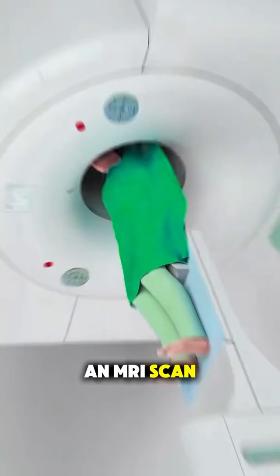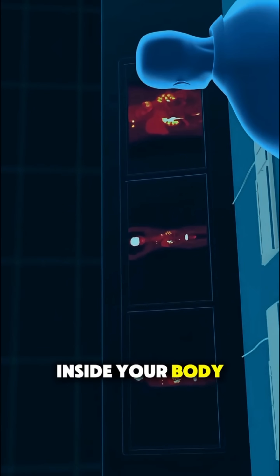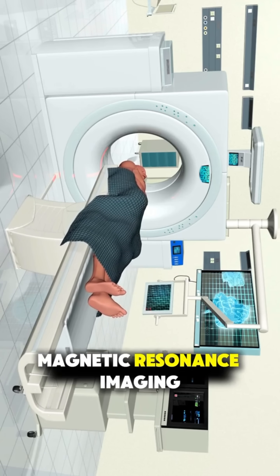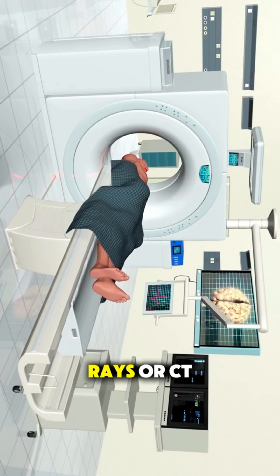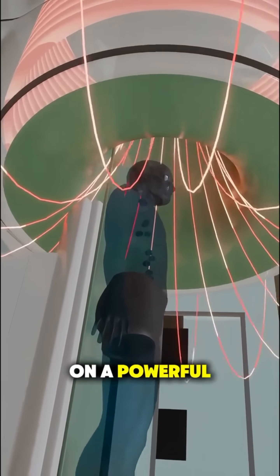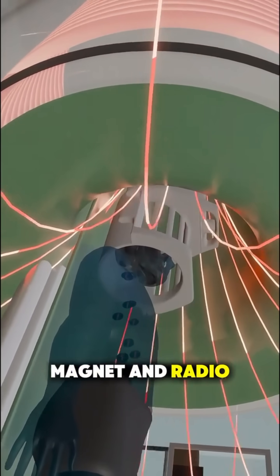Ever wondered how an MRI scan lets doctors see inside your body without a single cut? MRI stands for magnetic resonance imaging, and unlike x-rays or CT scans, it doesn't use harmful radiation but instead relies on a powerful magnet and radio waves.